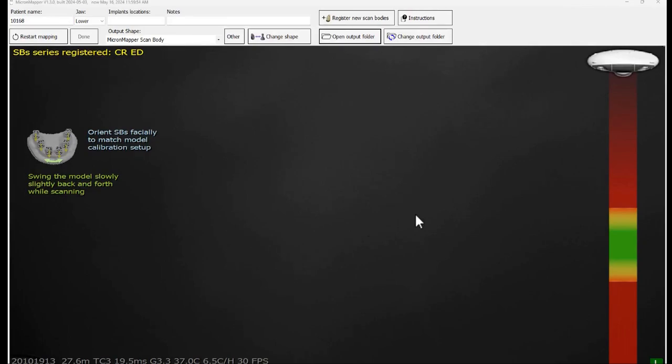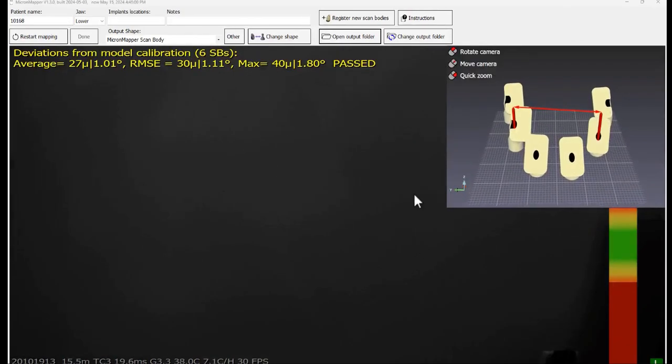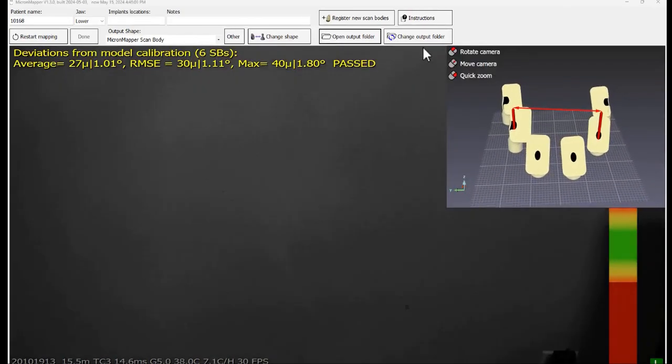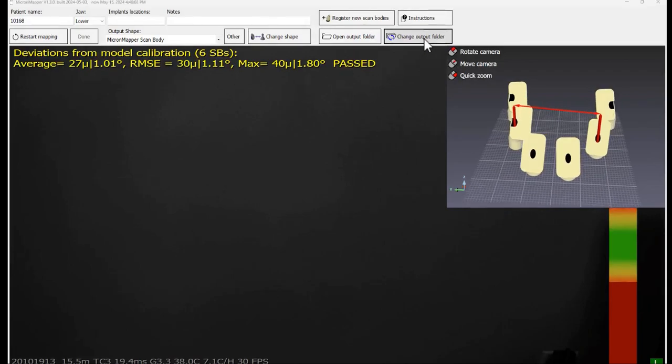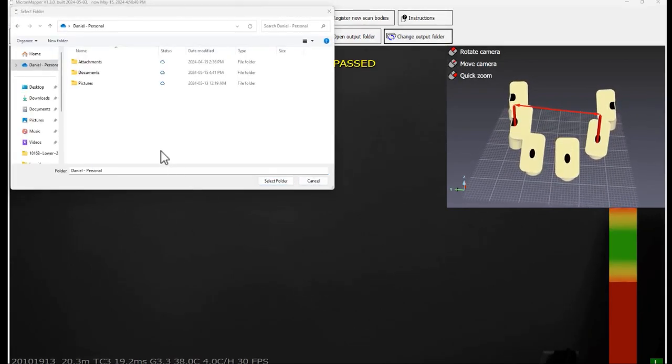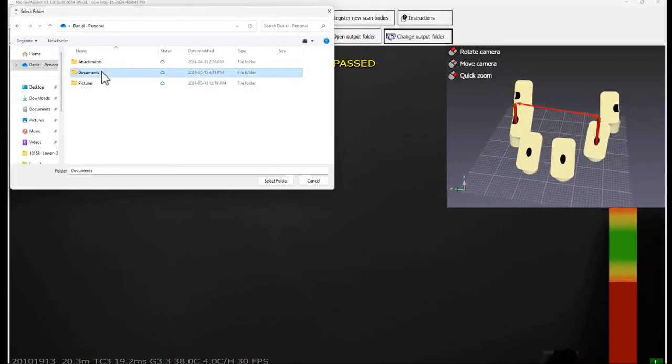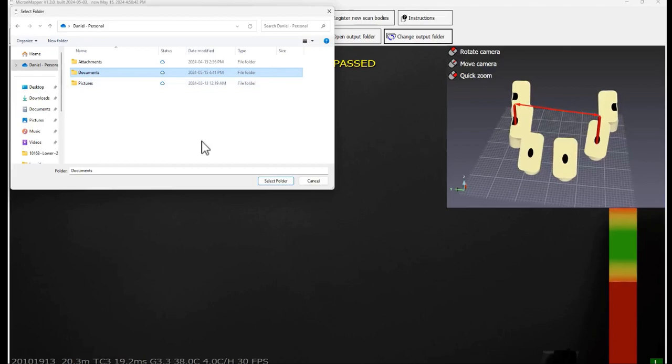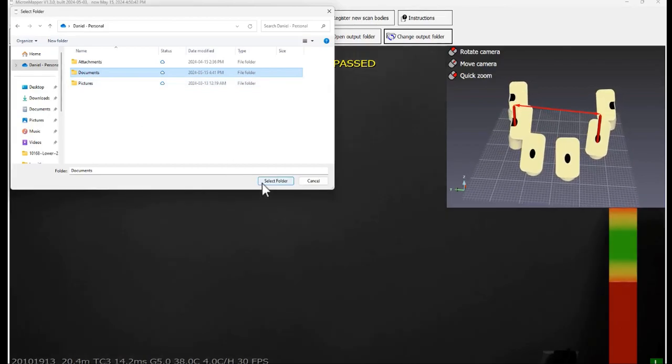You can change the output folder where the results are saved by clicking on change output folder button. Select the folder you want to save the results to and click on select folder.